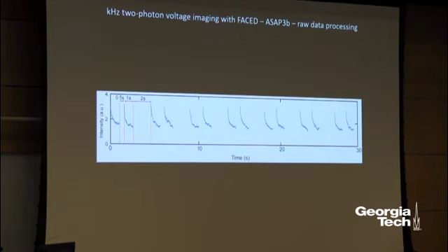But the interesting thing is that when you continuously take data, we do have a stop. For example, when we're giving the animal a blank stimulus, we stop. You see the signal goes down, and then 0.5 seconds later, we scan again, and it goes back up. So several things are happening.